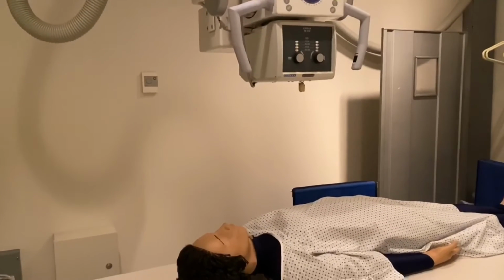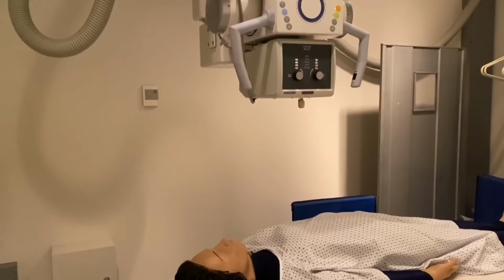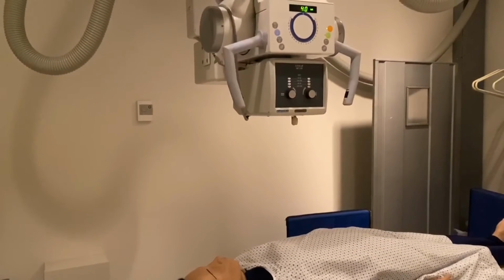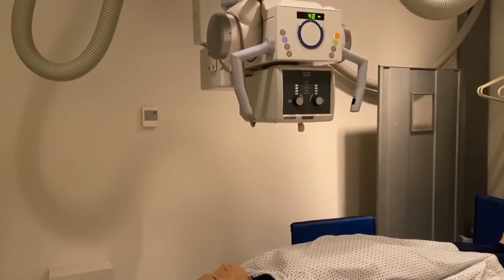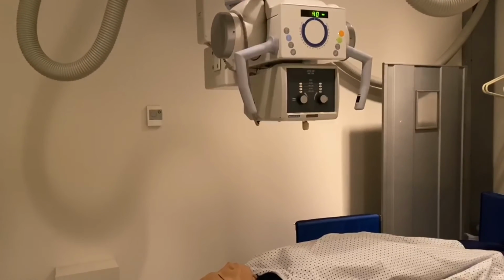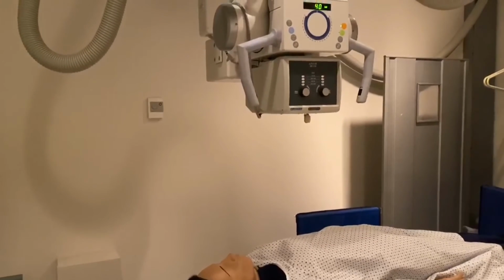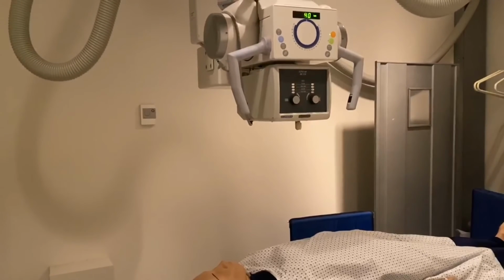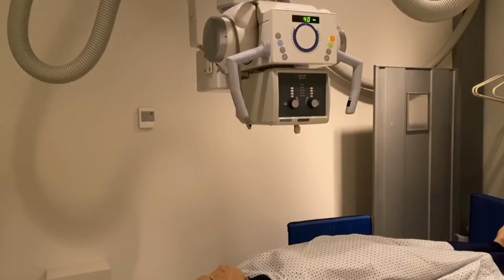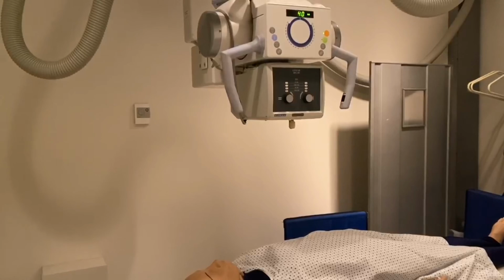You're going to have a 10 by 12 collimation, and then each individual group will have a specific position that will be assigned to you. For peer review, one person is going to be positioning and doing the control panel and everything. The other person will be evaluating them. Each person will have 5 minutes for the whole thing. This is just preparing you guys for semi-val, to make sure that you guys are consistent. So you'll have 5 minutes, and then you'll have 2 minutes to discuss your peer review, and then you'll switch.